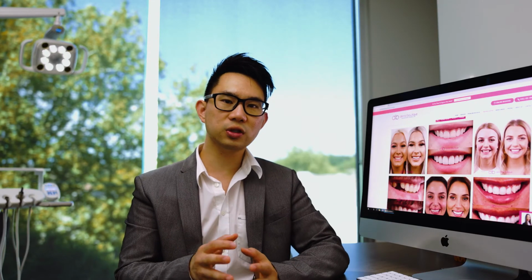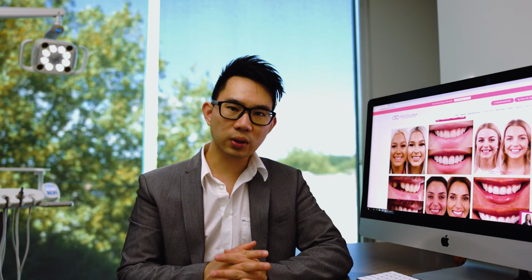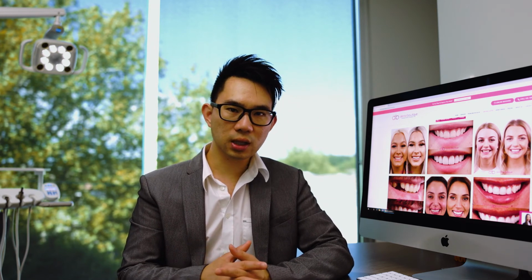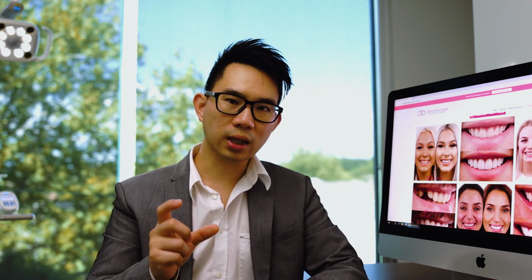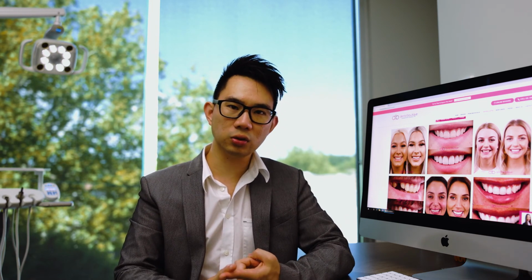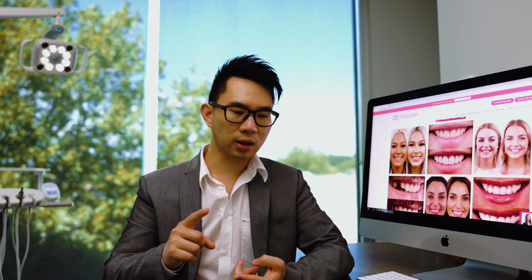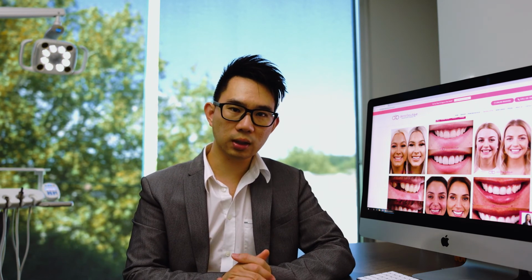The other question that we get a lot is, what is the cost difference between braces and clear aligners like Invisalign? In most cases, the difference between braces and Invisalign isn't much. You're looking at maybe up to $1,000 difference. The reason for that difference is that the material or product that needs to be used is slightly higher in cost. When it comes to the time taken to do the treatment, whether it takes more effort, it's all the same from the clinician's point of view or the patient's point of view as well. So the main difference is basically the material that's been used.